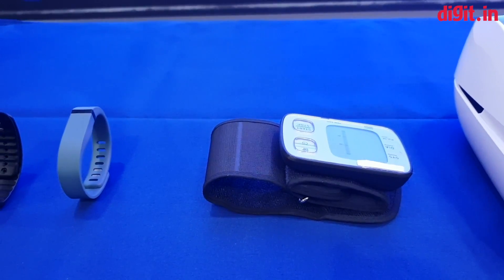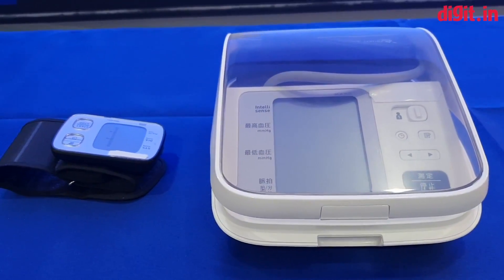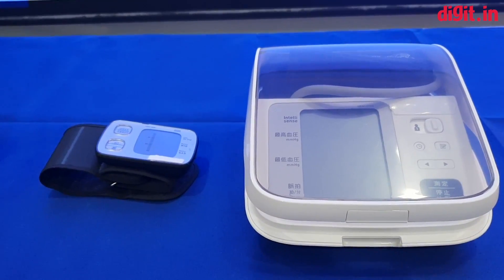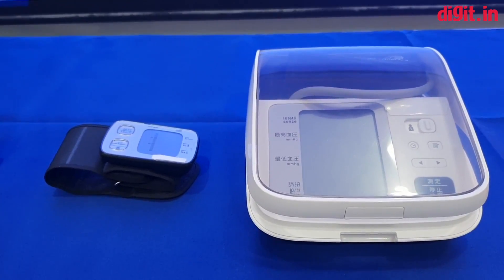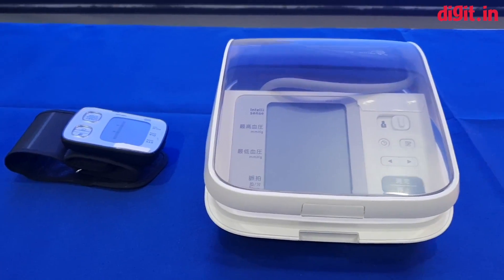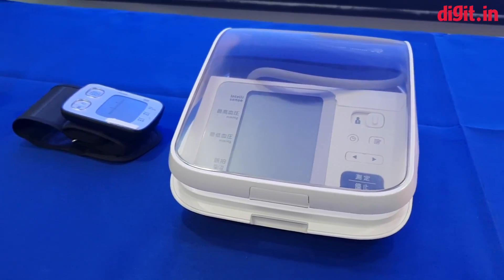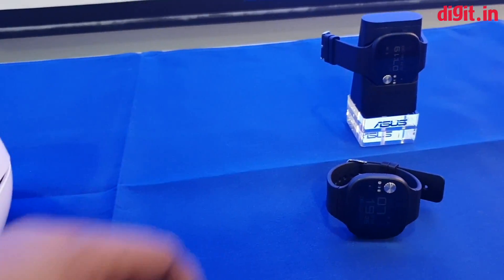This is a wrist-worn blood pressure measuring device, and this is a standard blood pressure measuring device. Asus says that hypertension is a big problem around the world these days, and the number of people affected by it is going to rise significantly by the year 2025. So their solution — not a solution to the problem, but a good way to tell if you're suffering from hypertension — is this.